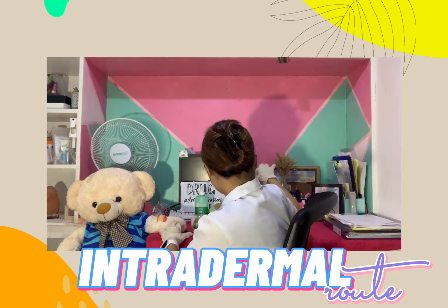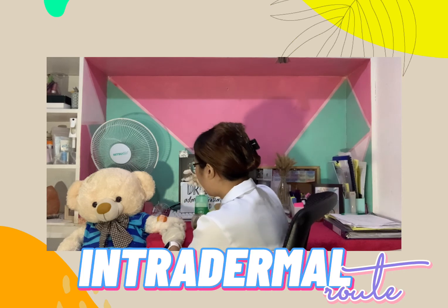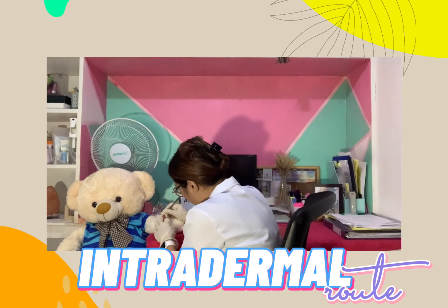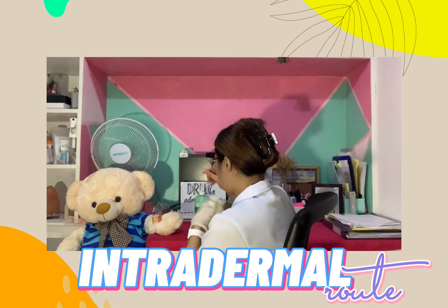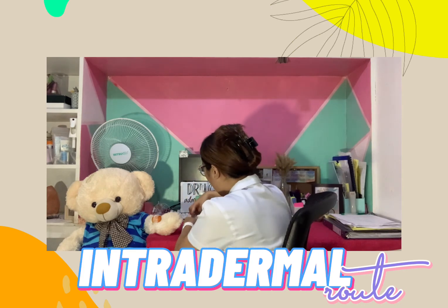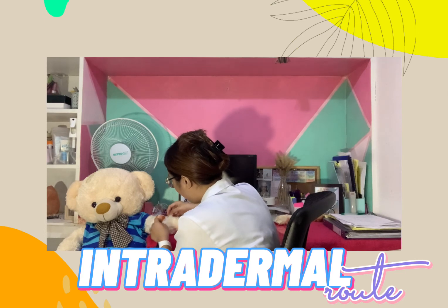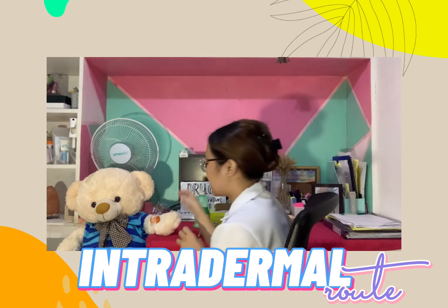So after discarding the syringe, we will put on a circle. We will encircle the area where we administered the medication, and then we will remove our gloves, and then we will perform hand hygiene, and then we will write the medication name and the time of the end of the skin test.